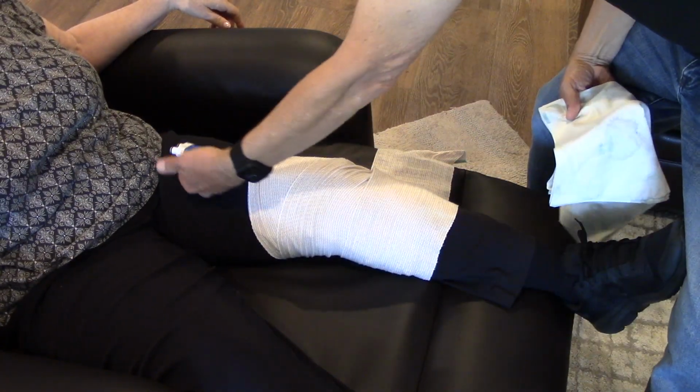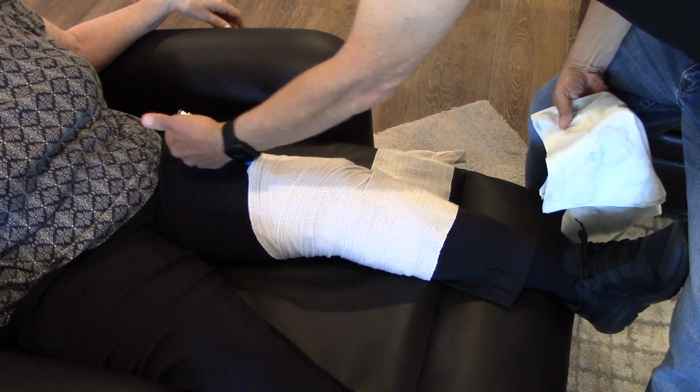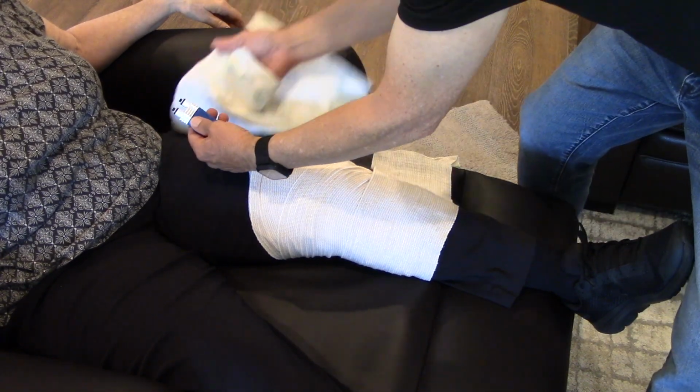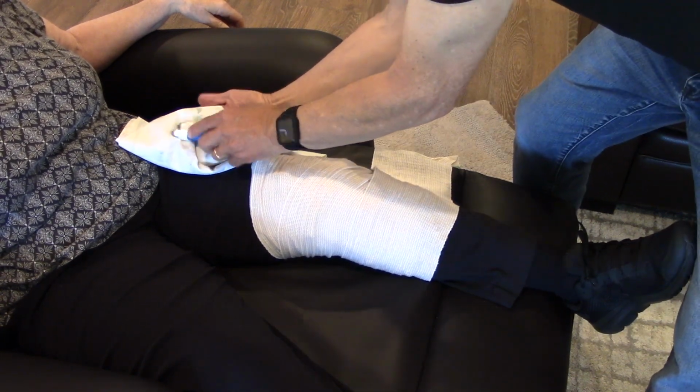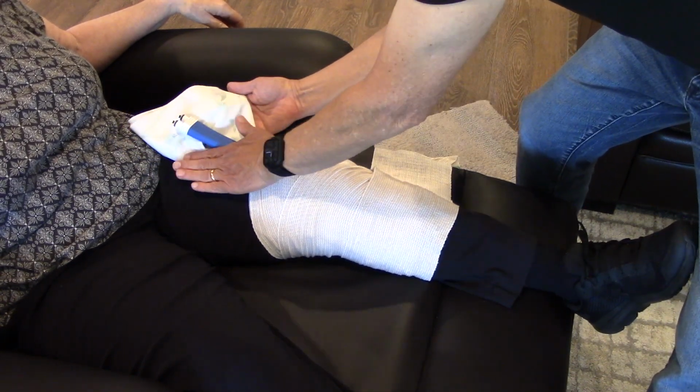Another suggestion, when you unplug this from the longer hose, you might want to take a hand towel and put it underneath here. And if there's any dripping, it'll go on the towel and not on you or the bed.